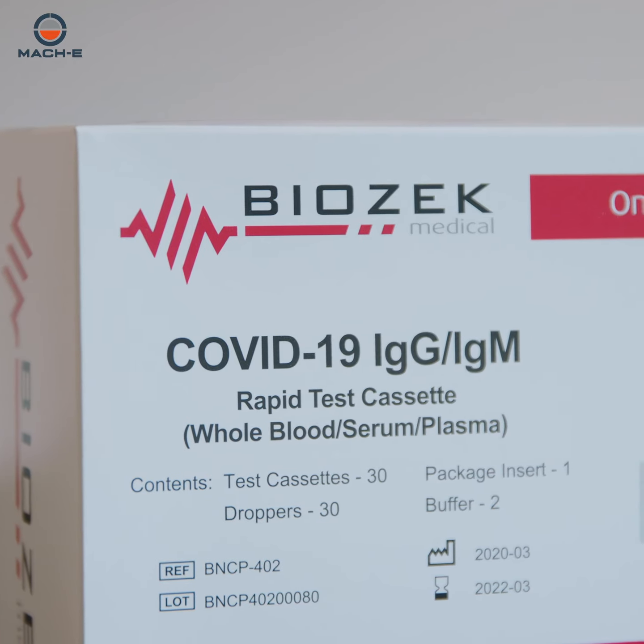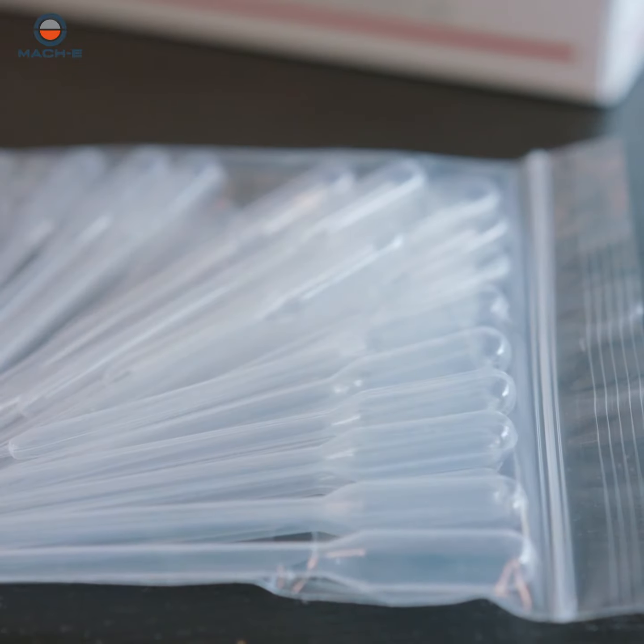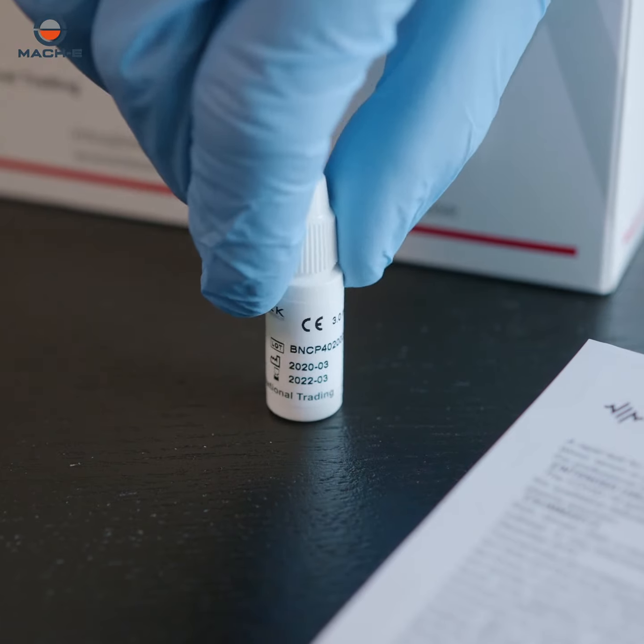MEC-E, distributor of the BioZec brand of testing products, presents instructions for the proper use of the COVID-19 rapid test.